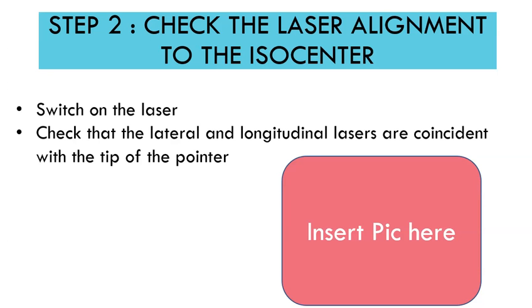Once you have confirmed the ISO center, step two is to check the laser alignment to the ISO center. Switch on the lasers and check if the lateral and longitudinal lasers are coincident with the tip of the pointer.